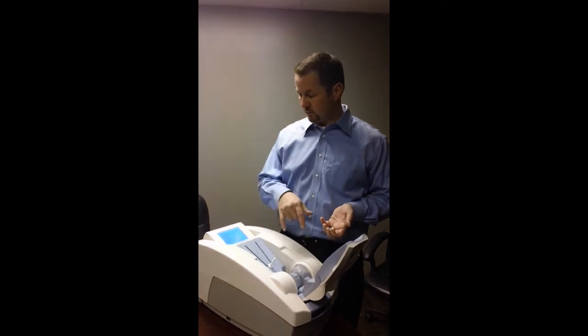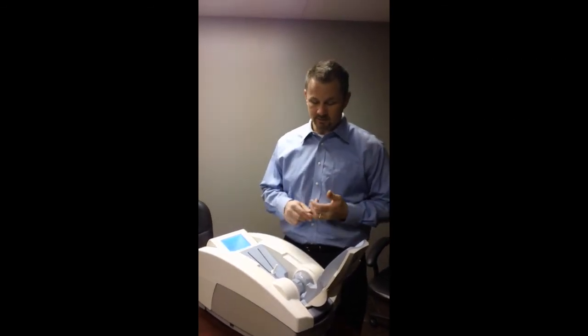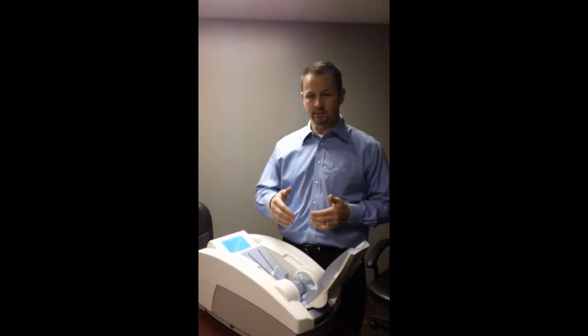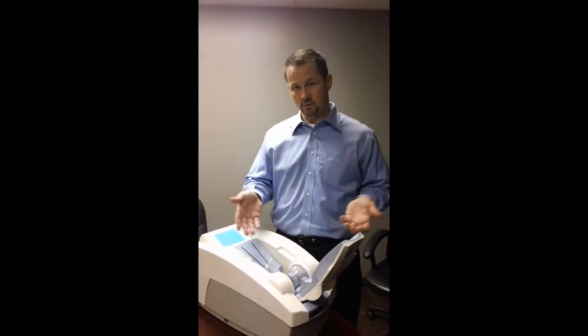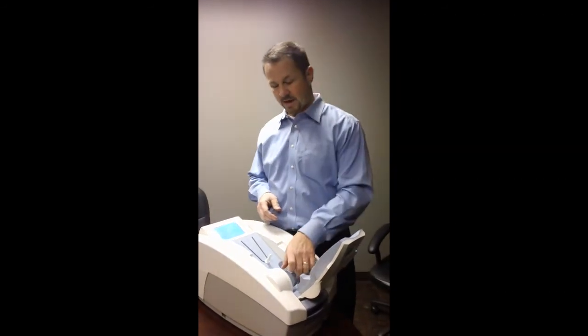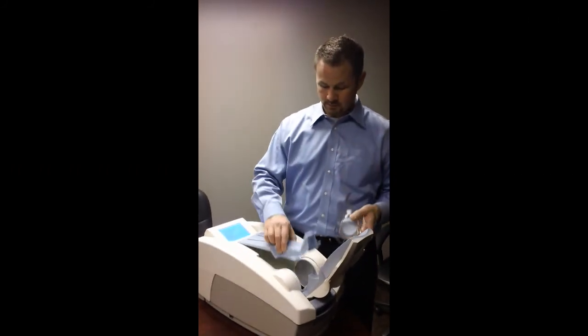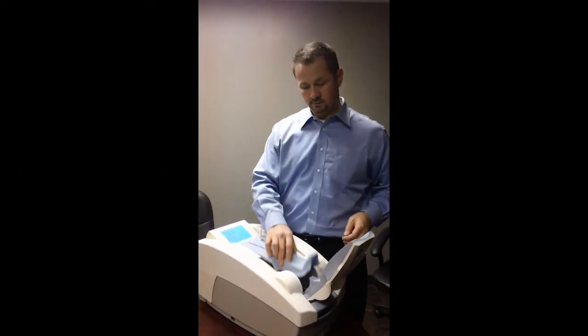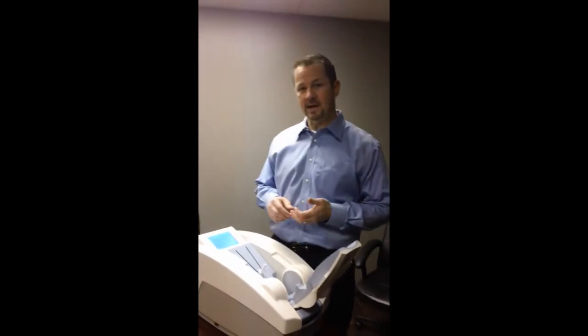Typically this process takes about a minute to a minute and a half. I would expect that this unit will be done any minute now, and then you'll hear the system make some noise — the membranes will separate from each other. At that point I can simply take out the QA cylinder, place it back underneath here until next time I need it in a week from now, and I'm ready to scan my first individual.